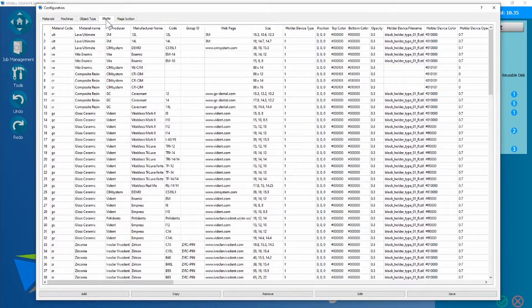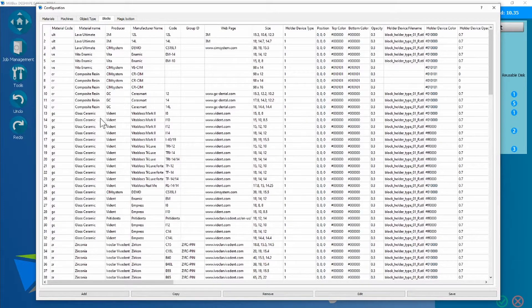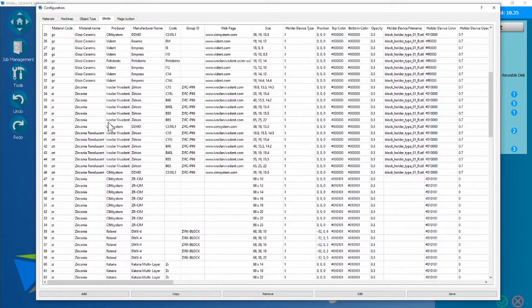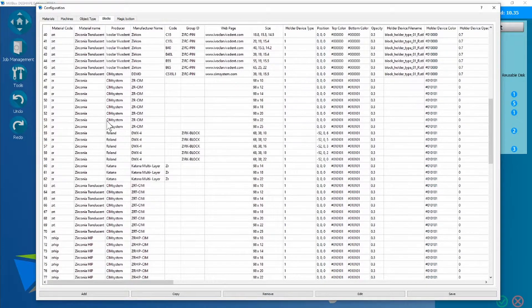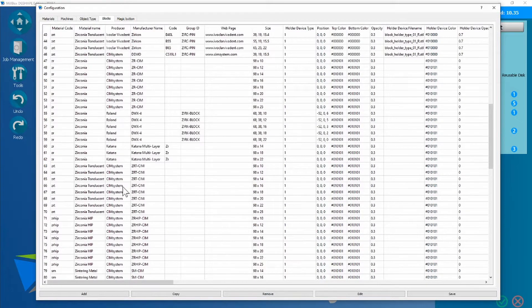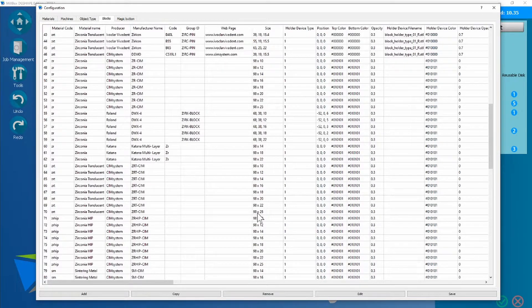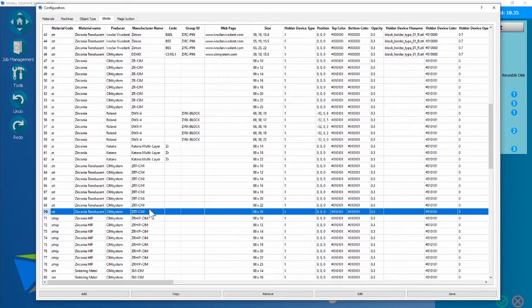It's already on the blocks tab, so we're going to go and find that code now, zrt-cim. This is the 25 mil disk, so we're going to click on this and copy it.